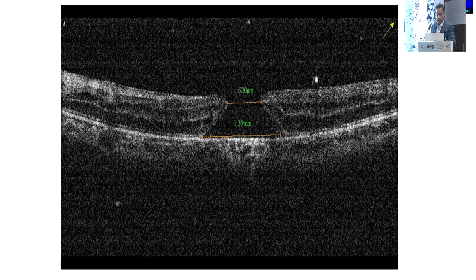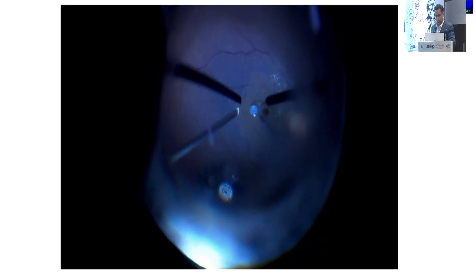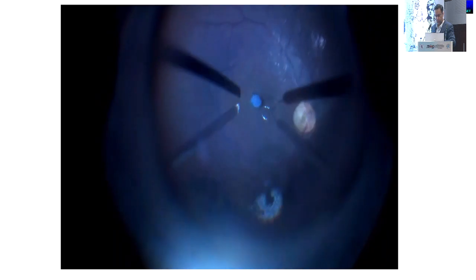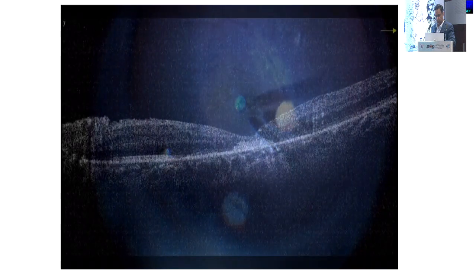This RD case came post-operatively with an attached retina but had developed a macular hole and oil emulsification. We did a silicone oil removal and bimanually placed a HAM graft into the macular hole. See how beautifully the hole has closed.